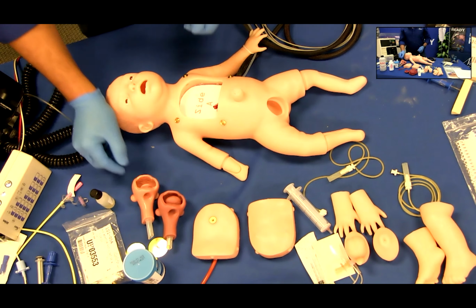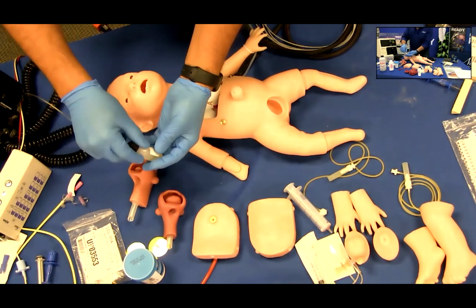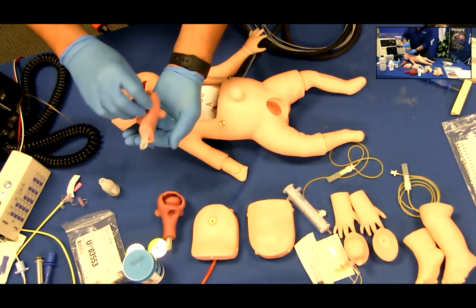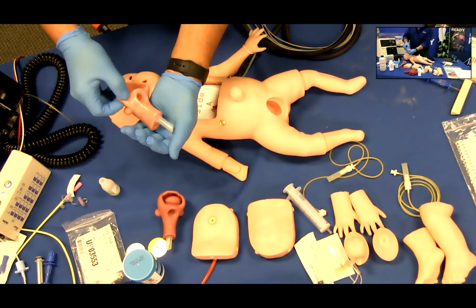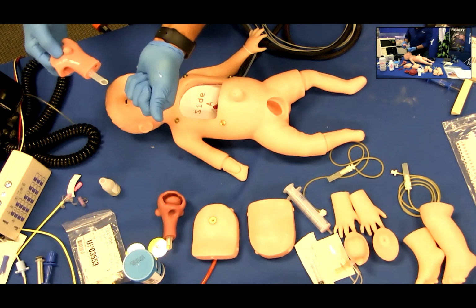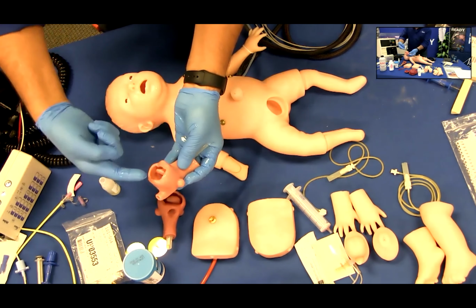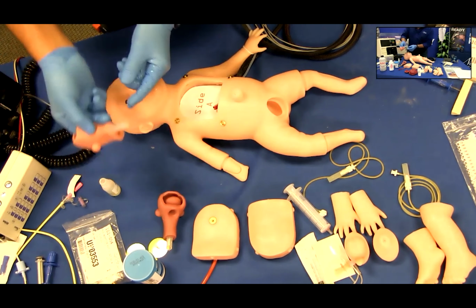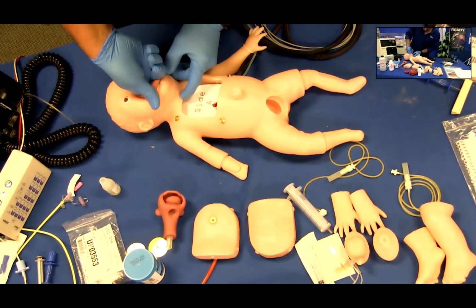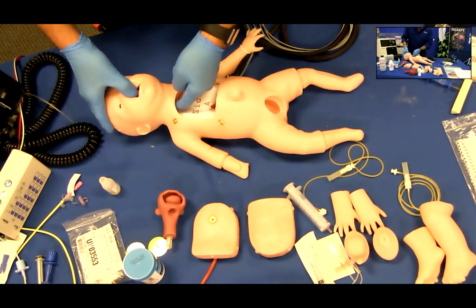Installing the airway. With the included lubricant, thoroughly lubricate all of the outside surfaces of the airway and around the mouth of the simulator. Gently insert your lubricated finger into the airway. Push the tube end of the airway into the mouth of the simulator and slide the airway down into the head, making sure to free the lips as the airway slides into place.